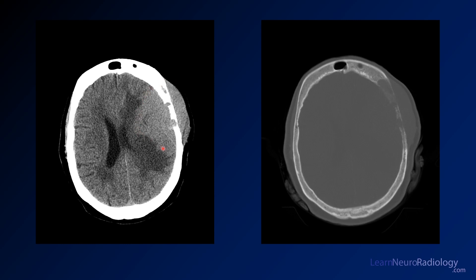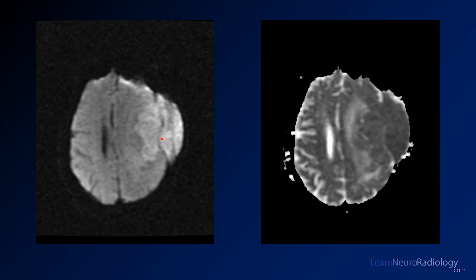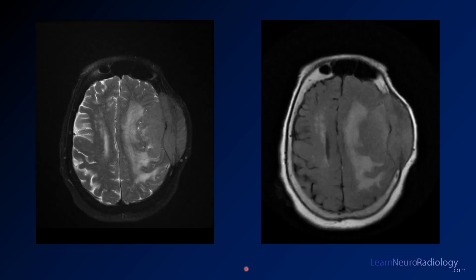On the CT at the brain window you see a mass with something very dense filling up the extra-axial space, and mottled areas where the bone is lost. In the bone window you see bone loss, areas where the cortex is destroyed, and mass on the outside of the calvarium as well. On MRI it's somewhat bright on DWI and dark on ADC, suggesting a cellular, tightly packed lesion. On T2 you get the idea of an extra-axial mass — perhaps a few areas with a cleft of CSF — centered either in the bone or along the extra-axial space. FLAIR shows quite a bit of edema superimposed on likely some mild microvascular disease.